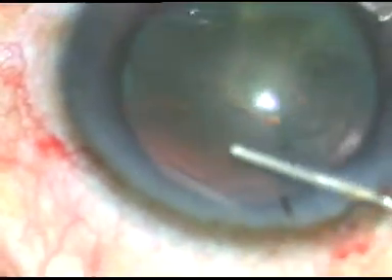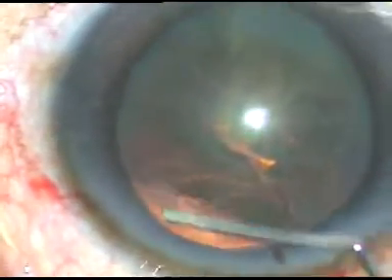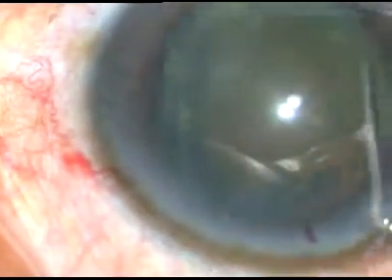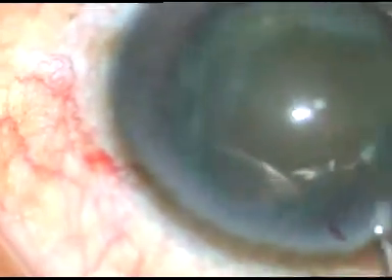I am going to inject the BSS into the fornix of the capsular bag, and with some more hydrodissection, the nucleus prolapses out of the capsular bag.